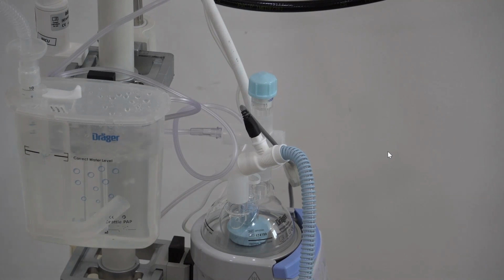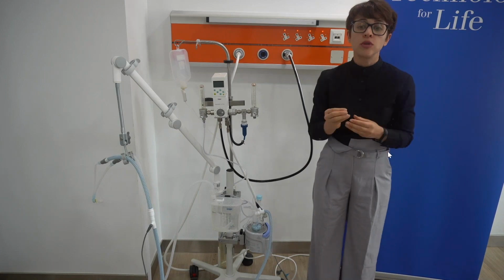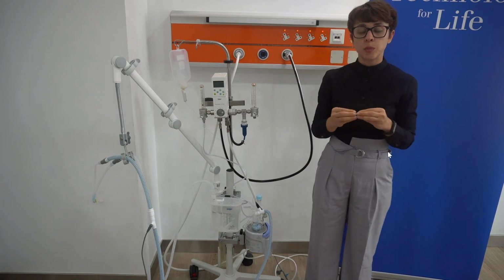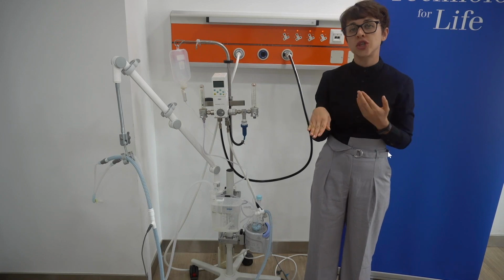Excellent, thank you, Linda. I think we should refer back to what you said about mechanical ventilation. You mentioned that in spontaneous breathing, the inspiration is active, so we actively inhale, and the expiration is passive.